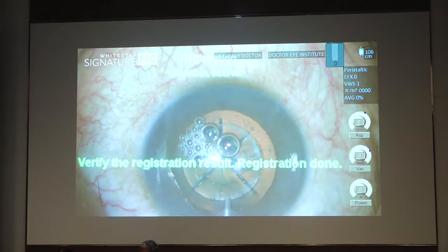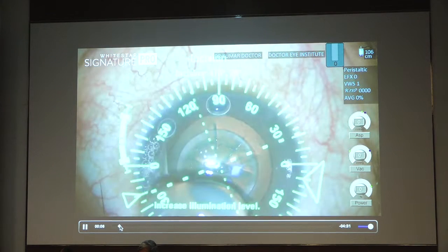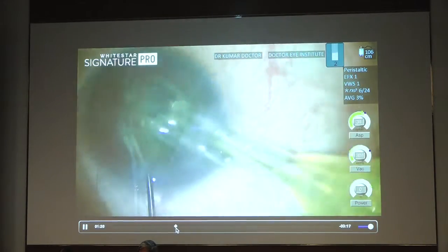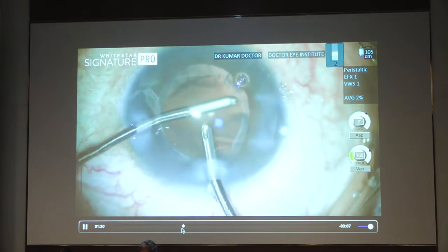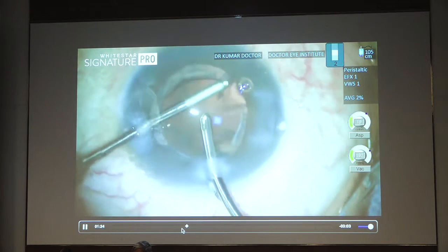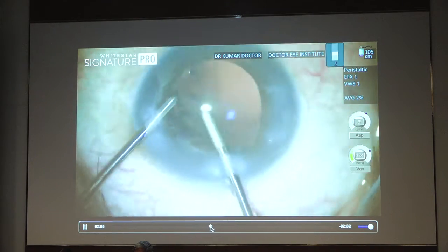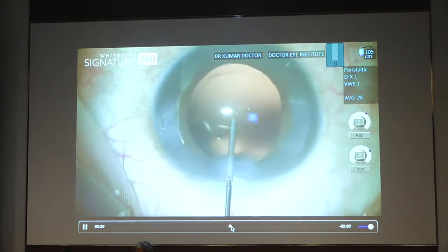I'm just showing a little bit of the surgery here. Very, very shallow anterior chamber. I performed a Z8 femto, made the incisions with the laser itself, picked up the rhexis, and went ahead and did phacoemulsification. Very surprisingly in this case, in spite of clearing a 4.37 lens, I did not find so much space as far as the IOL was concerned. Here I'm doing bimanual IA. After a femto, the bimanual IA is a little different from the normal IA.